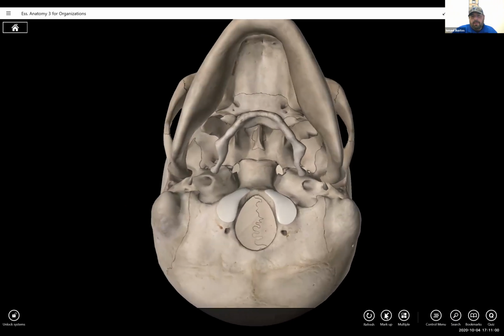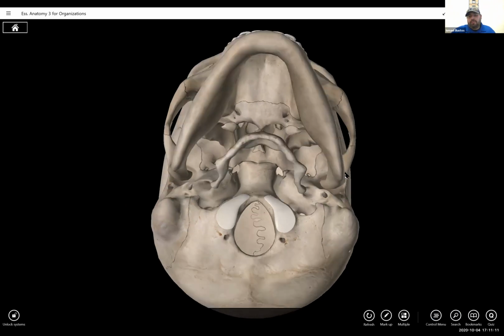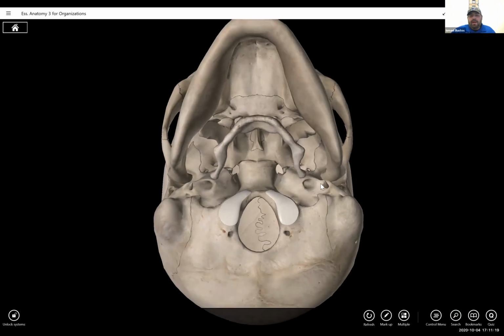You see this condyle here, that structure on each side. Those condyles should be free of these mastoid processes down there. If you see those condyles getting into those mastoid processes, that means you are not extended enough. Another reason could be that your CR is not perpendicular to the IOML.